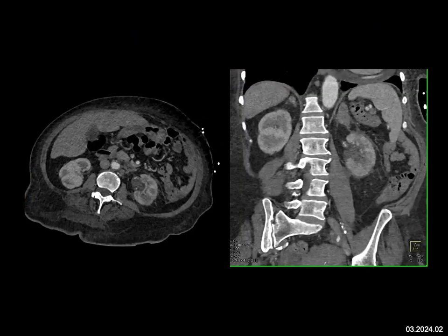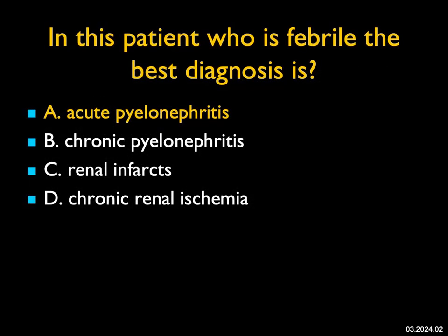In this patient who's febrile, the best diagnosis: there's decreased attenuation of the left kidney compared to the right, the corticomedullary interface is poorly seen, and there's some stranding around the kidney. All of these changes together give you the diagnosis of acute pyelonephritis. You can see some of these changes in chronic pyelonephritis, but when you have them all together and the kidney looks like this, it's acute pyelo. It's not the appearance of renal infarcts nor chronic renal ischemia.